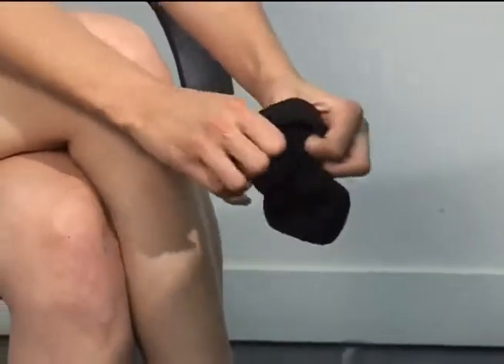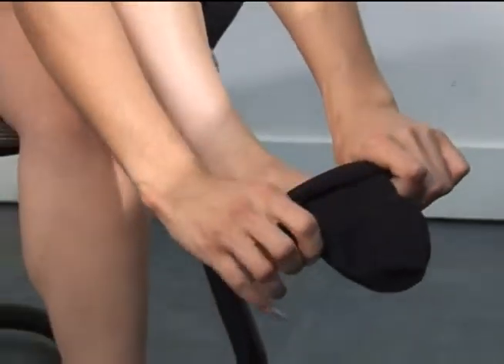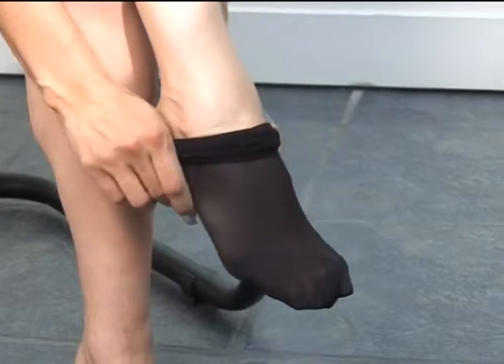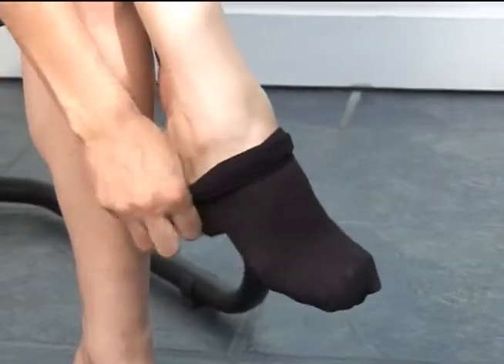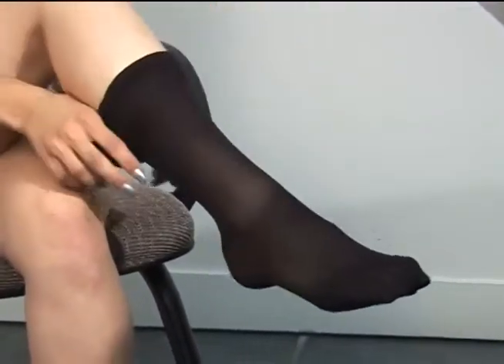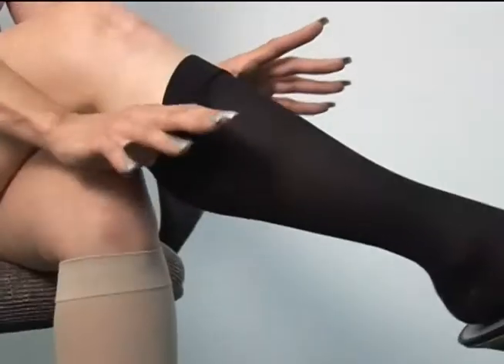To put on our compression stockings, first gather the entire stocking foot and leg in hands, then ease over the toes first, stretching as you go. Continue by gradually easing over the foot and up the ankle, always stretching and easing to achieve a smooth, wrinkle-free fit.